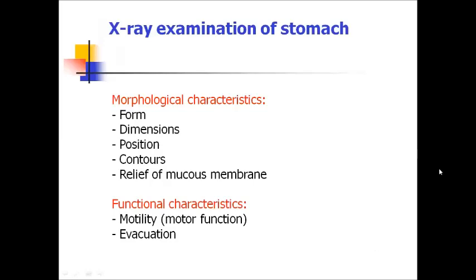X-ray examination of stomach can show us morphological and functional characteristics. Morphological characteristics are form, dimension, position, contours, relief of mucosal folds of stomach, and a functional characteristic also very important is motility of the organ or motor function, and evacuation, complete or incomplete.